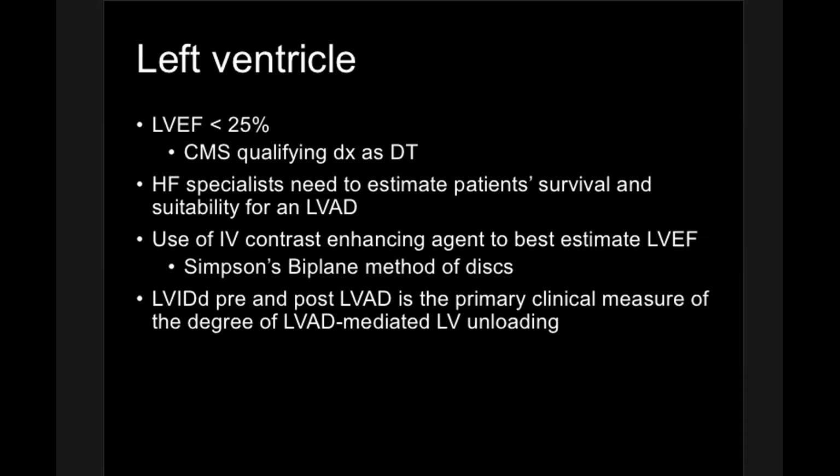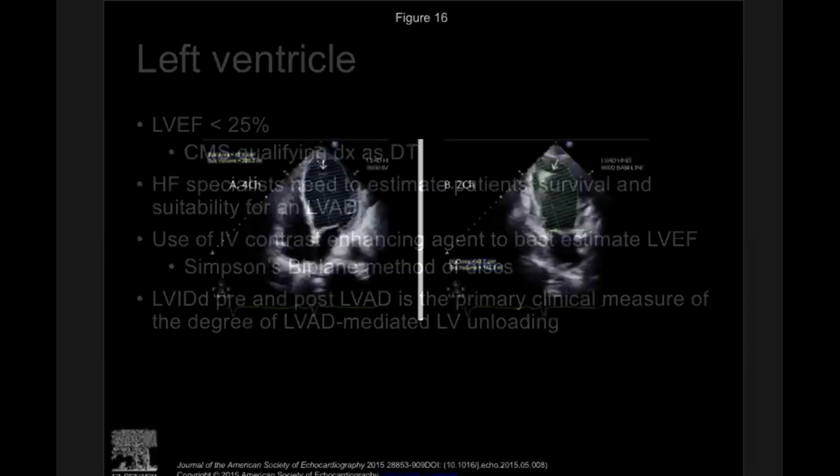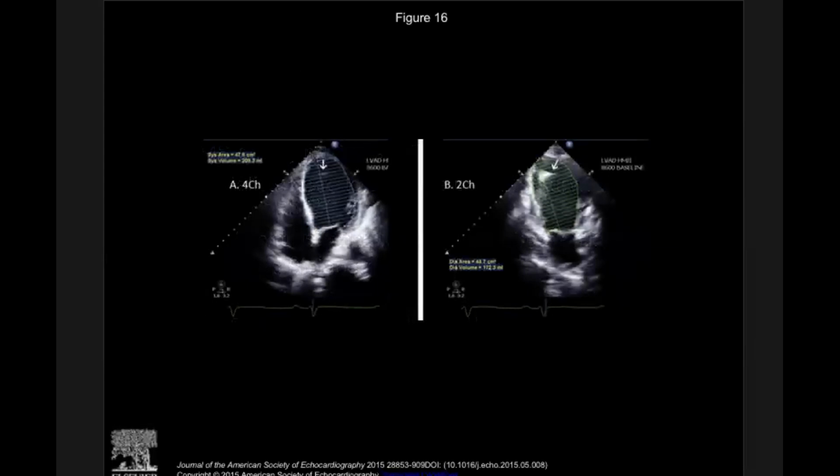A comparison of pre and post LV end-diastolic volumes would be better to quantify the LV unloading. These measurements, though, can be very challenging to obtain secondary to patient positioning, mechanical ventilation, sternotomy, and bandages. So this is just an example of a 4-chamber and 2-chamber view using the Simpson's biplane method of discs, which is the preferred method for the LV size.